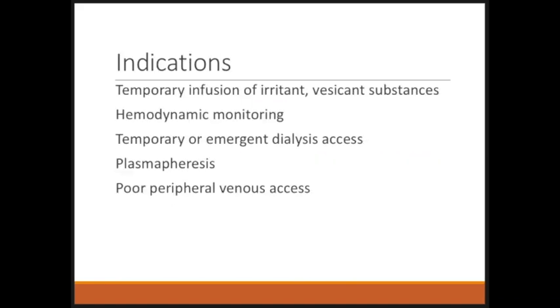So common indications you've probably seen before would be substances that require central venous access like vasopressors or emergent dialysis, placing a temporary dialysis catheter. Those dialysis catheters can also be used to remove antibodies during plasmapheresis.